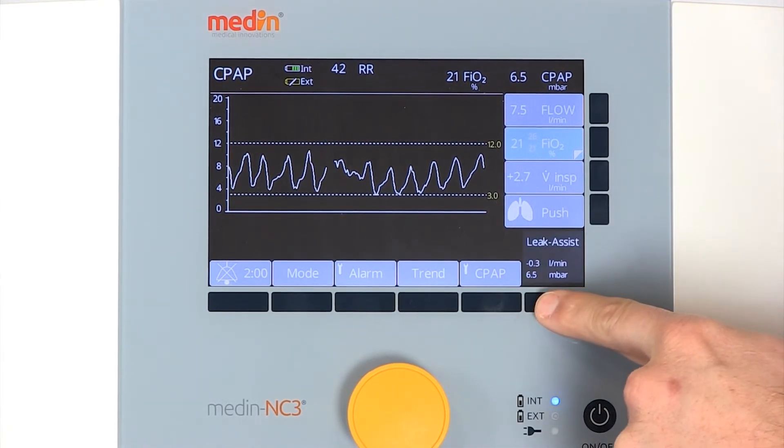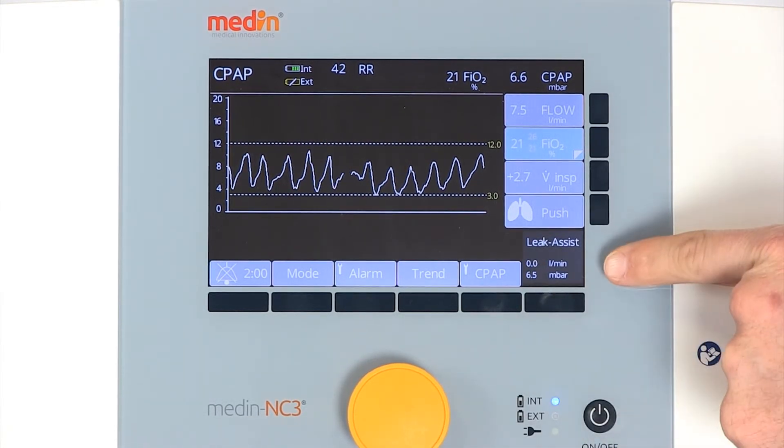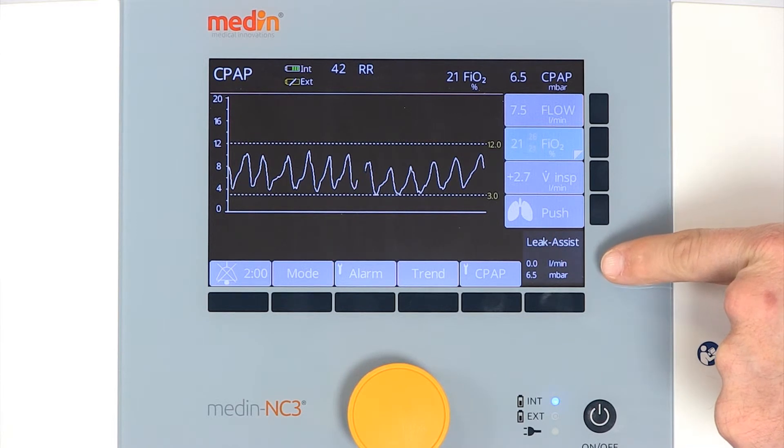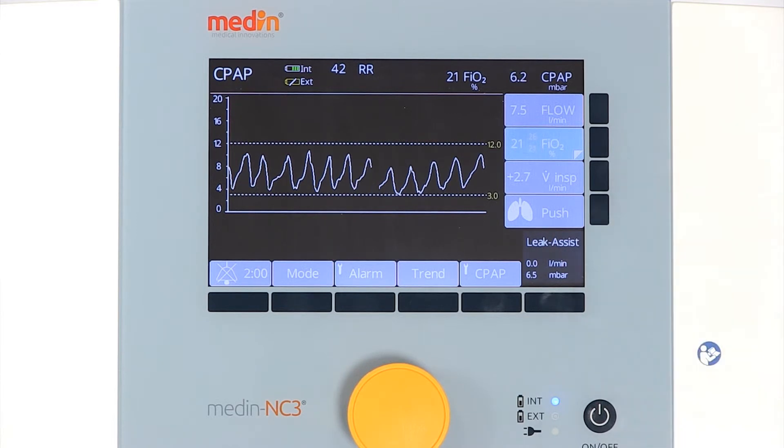A tight-fitting CPAP system and efficient application guarantee a constant CPAP pressure and effective leak compensation.